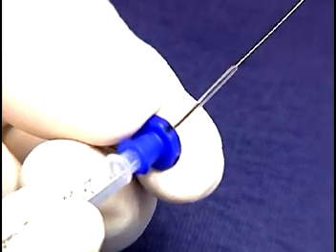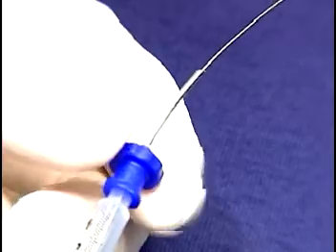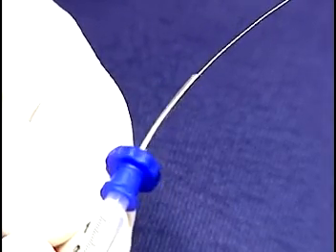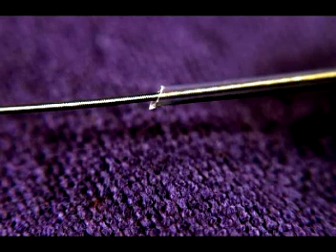Once an appropriate tube is selected, it is placed on the intubation guide wire. The tube is positioned so that the tip is on the inside of the curve of the guide wire, seen here and here. If the tip is not properly oriented, it may pull away from the guide wire, as seen in this view, and cause difficulty or trauma as it passes the cords.